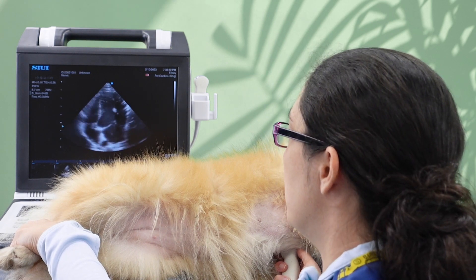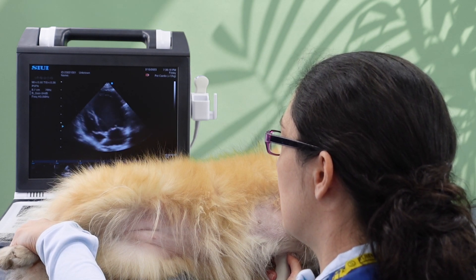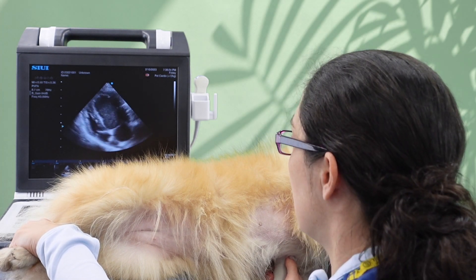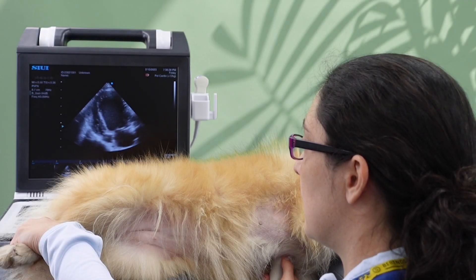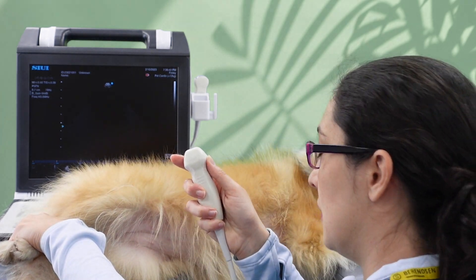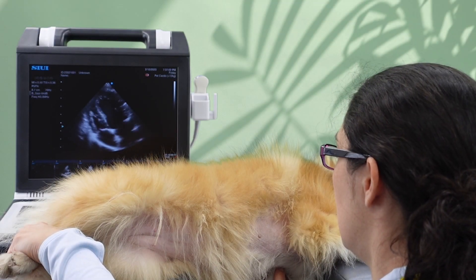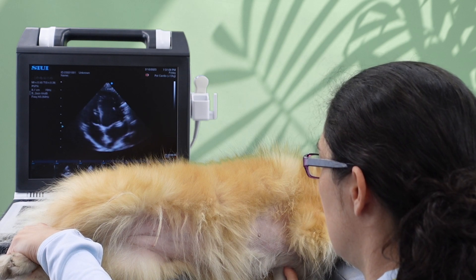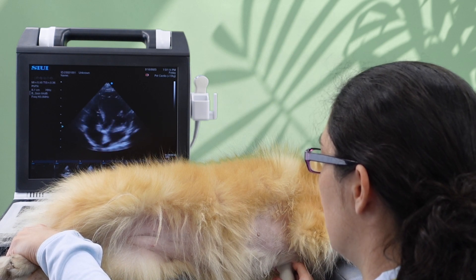To optimise your apical four-chamber view, you need to make sure that the septum is straight down your screen. If your image is like this, that's called being off-axis. The movement to correct this is a simple rocking motion. So back to an off-axis image and then rocking my hand, that's bringing the septum back into the centre of my screen again.